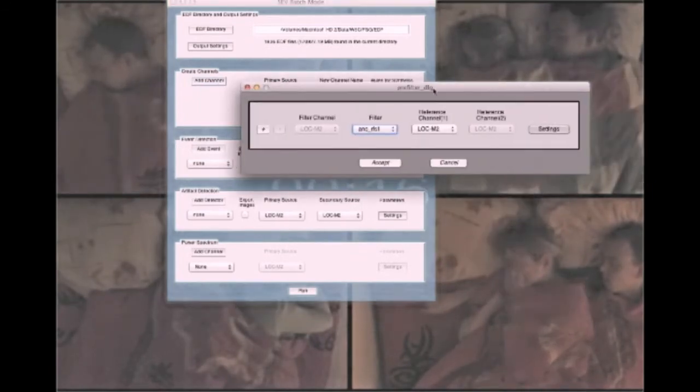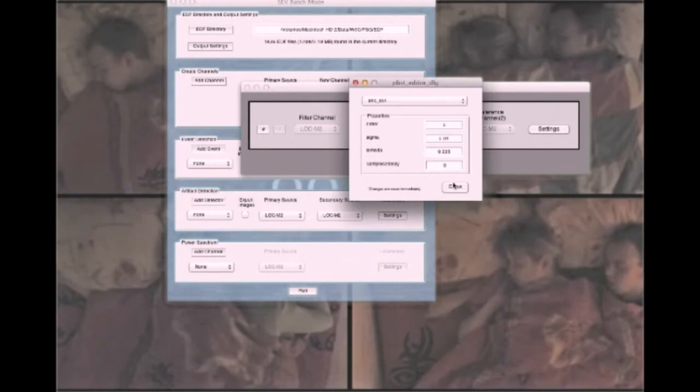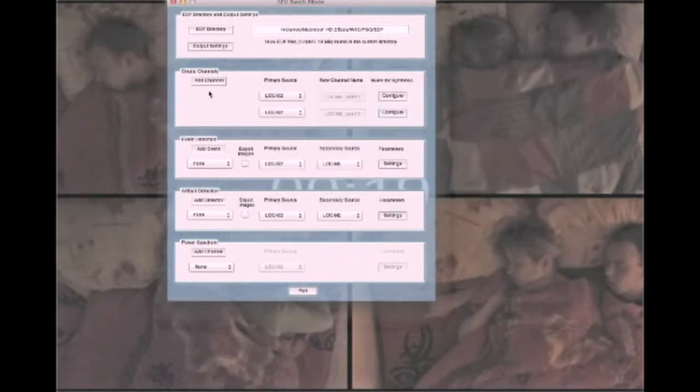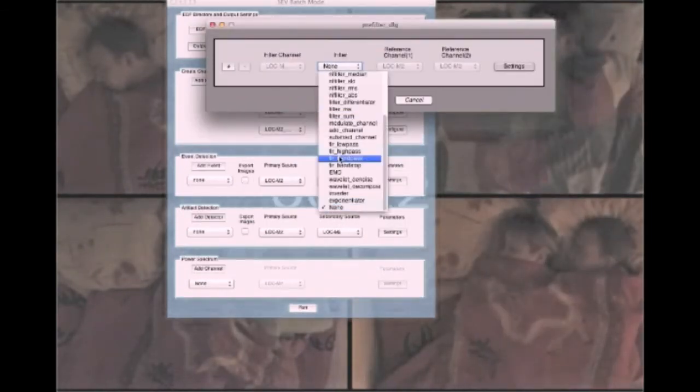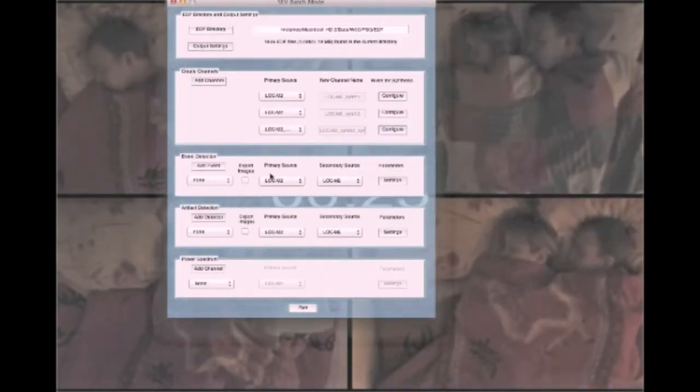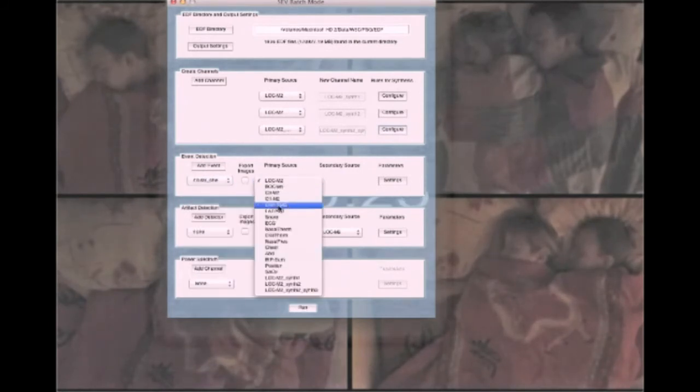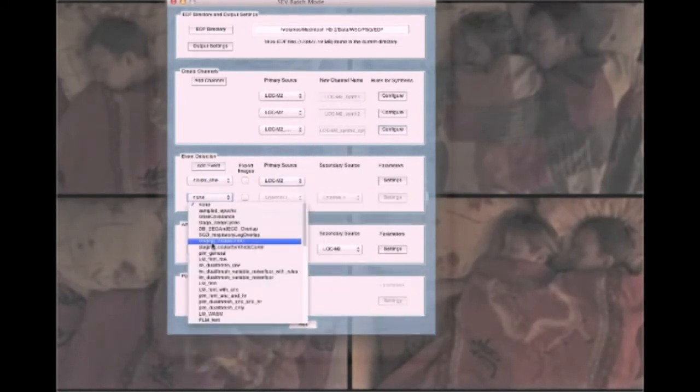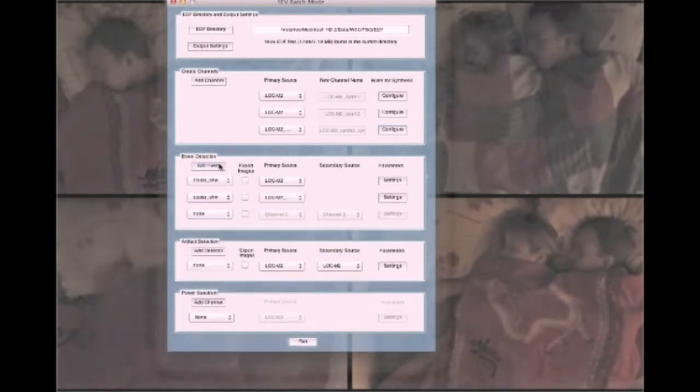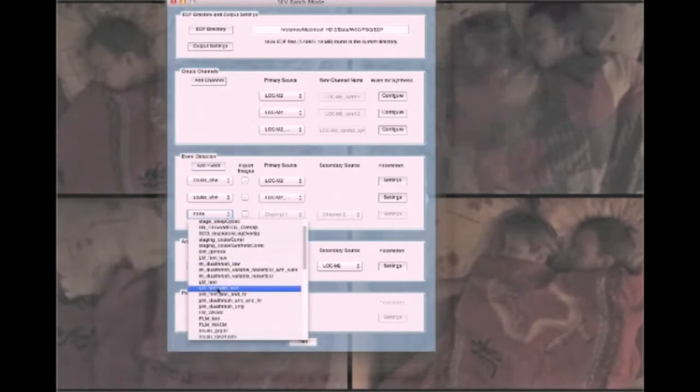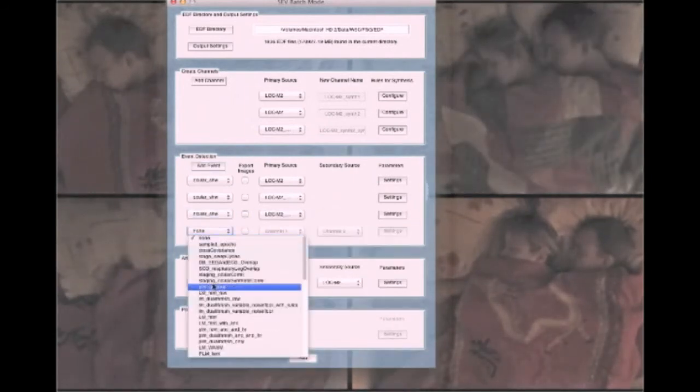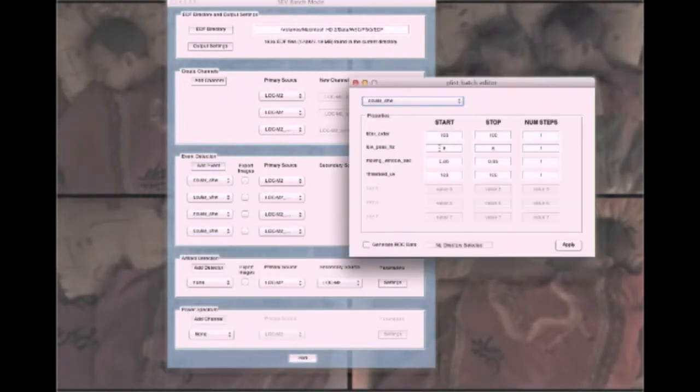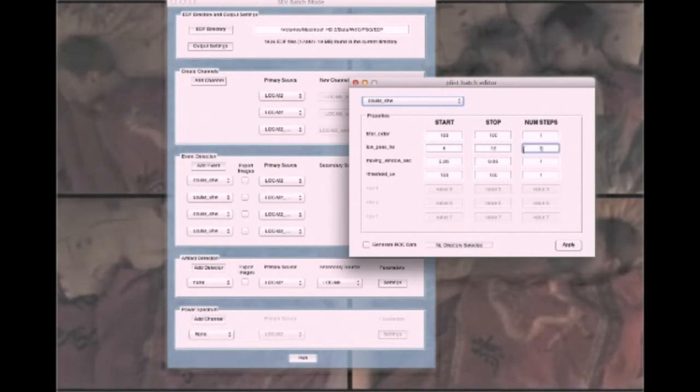In addition to regular EDF channels, new channels can be synthesized and configured for processing. Any of the SEV's detectors may be run on specific channels to detect phasic events or artifacts. When optimal detector settings are unknown, a range of parameters may be established to iterate through and try for each study with no additional loading overhead.